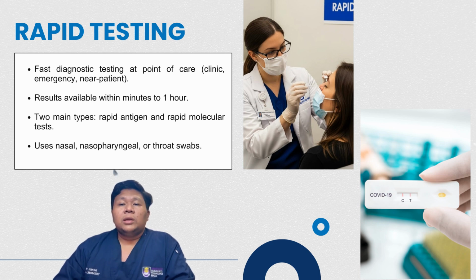These tests primarily use rapid antigen tests and rapid molecular tests. The samples are typically collected using nasal, nasopharyngeal, or throat swabs, which are non-invasive and patient-friendly. This immediate turnaround time is what makes rapid testing so valuable in clinical decision making.